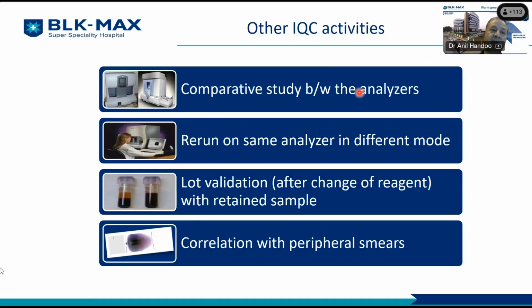The other important aspect that we need to keep in mind is that with most of our analyzers, we have a possibility of putting a sample in the analyzer either in a cassette, where it will be taken automatically inside, pierced, and the sample will be taken in. We can also just open the lid of the tube and push it into the analyzer. And this is the open mode. So you have two modes.